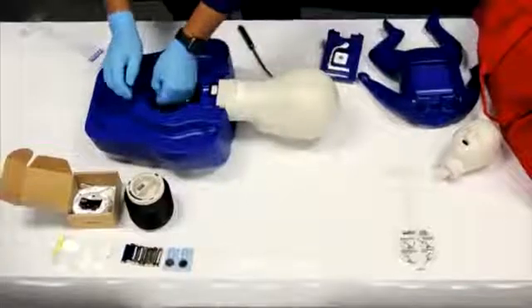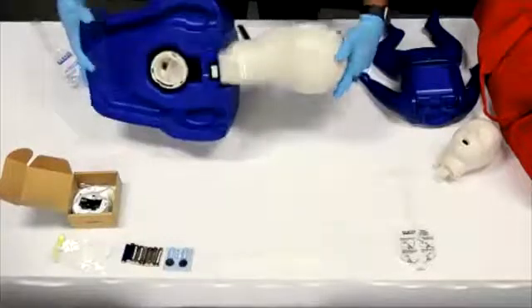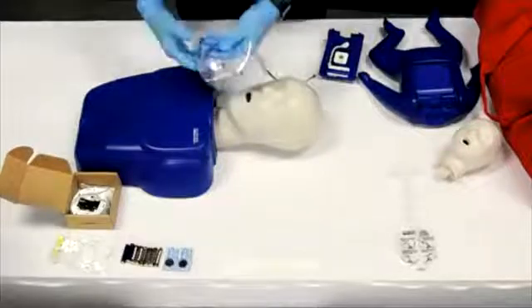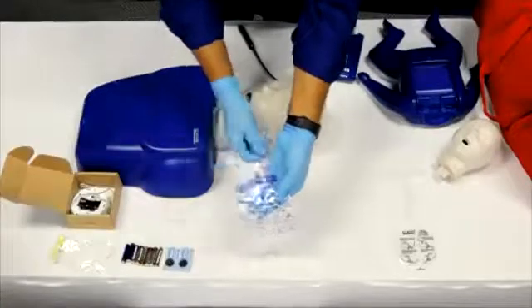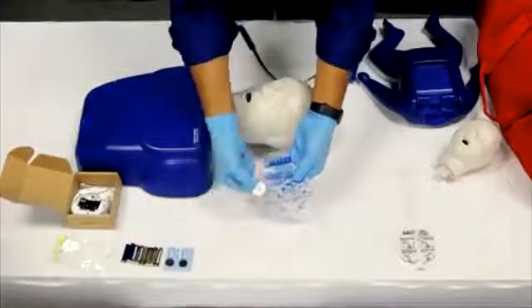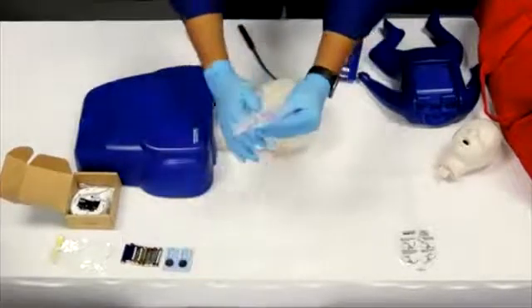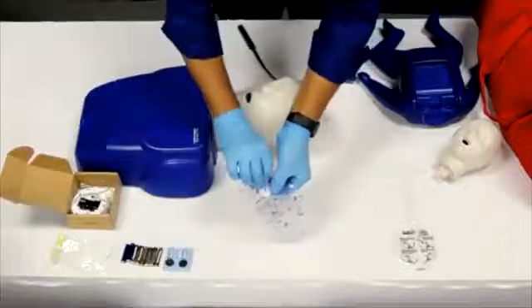Once that's done, we'll show you how to modify the lung bag for practice. This step is necessary to capture ventilation and feedback for adult mannequins and infant mannequins. Using the included hole punch, punch a hole in the upper right or left corner region of the bag. As you can see, we already have a hole in the bag. Breath modules are included. Breath module A, with a raised front, adheres to the front side of the punched hole. Then, breath module B, a flat circular sticker, adheres to the back side of the punched hole.